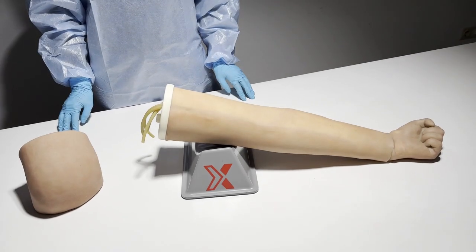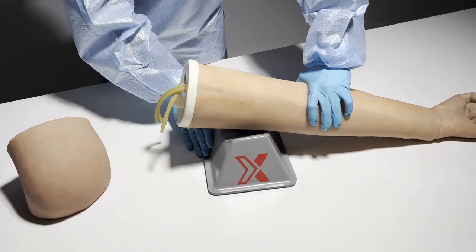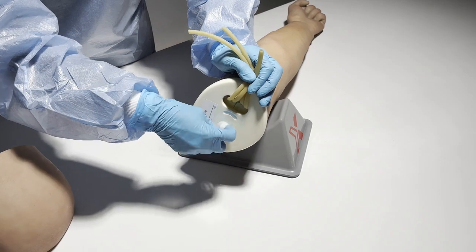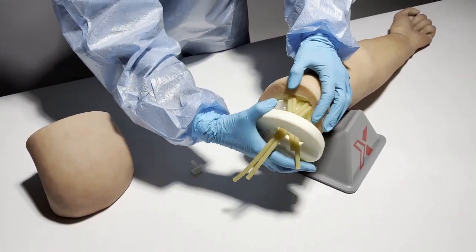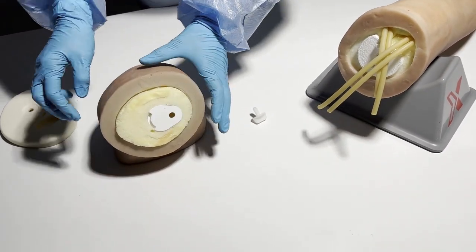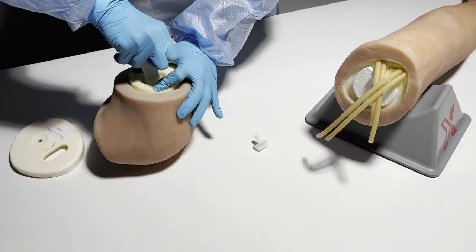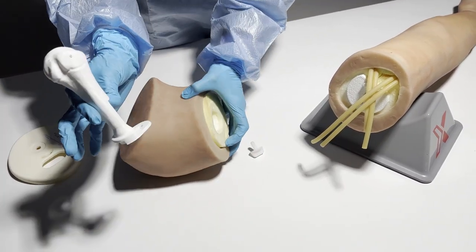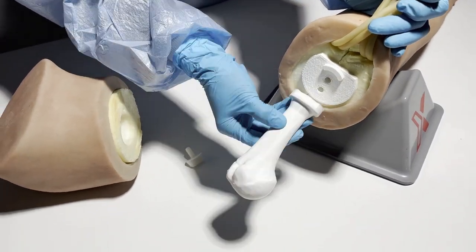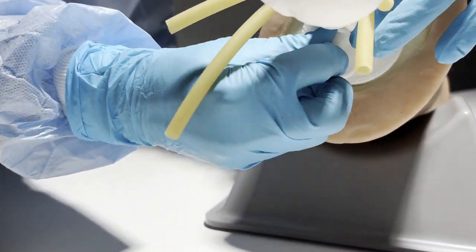Now we are going to show you how to put the deltoid add-on on the IV arm. There is a white screw on the IV arm — you can unscrew it. Then you can take out the plate, and in the deltoid you can see the bone part which you can take out. Once pulled out, you can attach the bone to the arm and screw the screw.